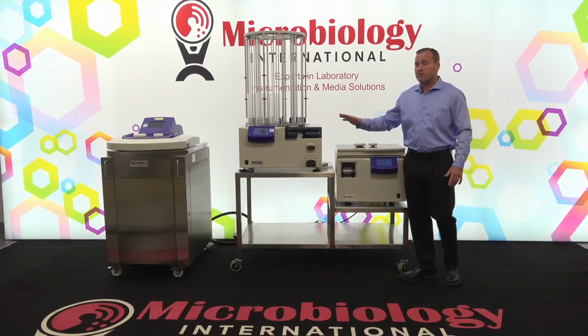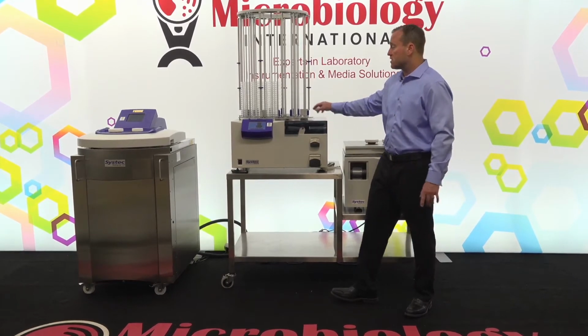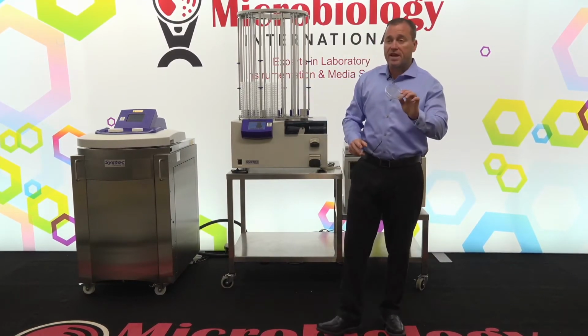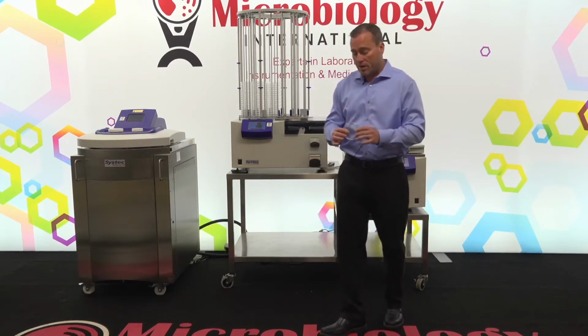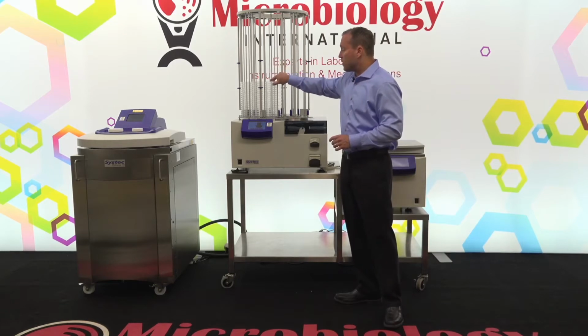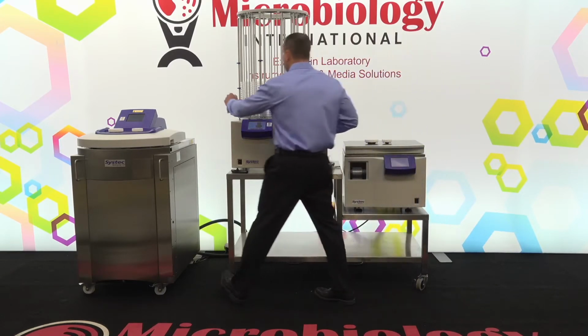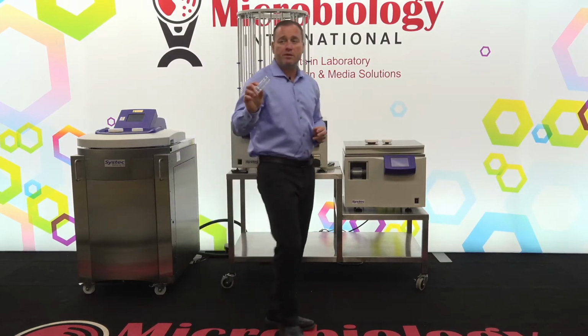Then we have the MediaFill system. This is the MediaFill 440. This is designed for 90 millimeter plates. So these 90 millimeter standard dishes, or 100 by 15, whichever way we like to term them, are the standard application for the system. This system can also dispense 60 millimeter or 35 millimeter plates as well. In addition to doing a standard 100 millimeter plate, we can also do deep dish plates.